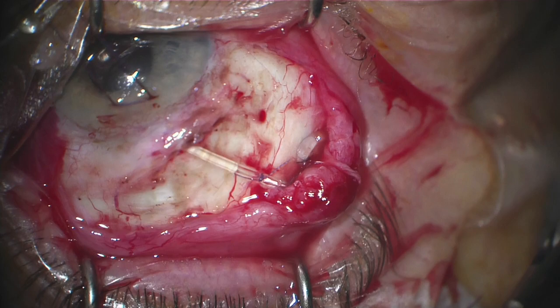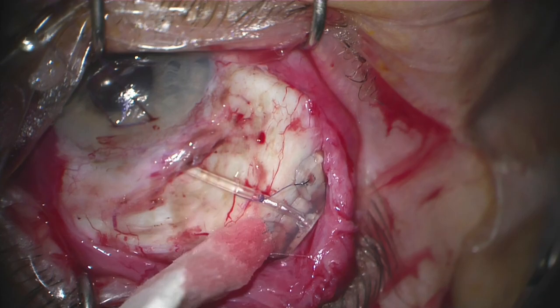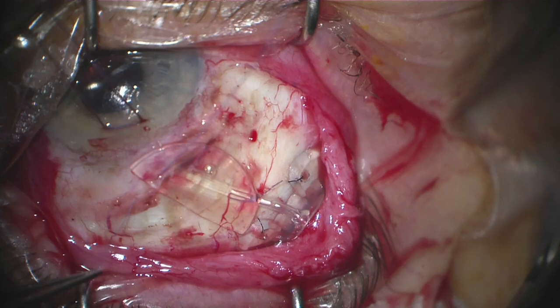Given this is a non-valved implant, we need some method to control the pressure early on, so I'll pass a 10-0 vicryl stitch just proximal to the occluding ligature. I want to see this nice percolation of fluid through that fenestration.